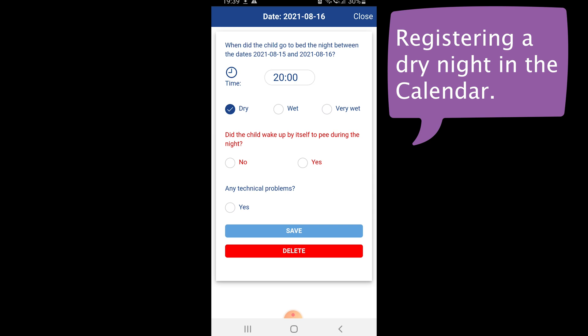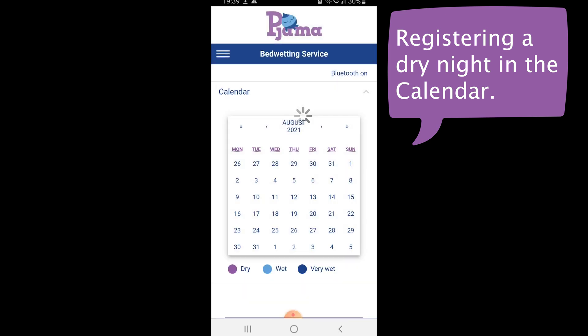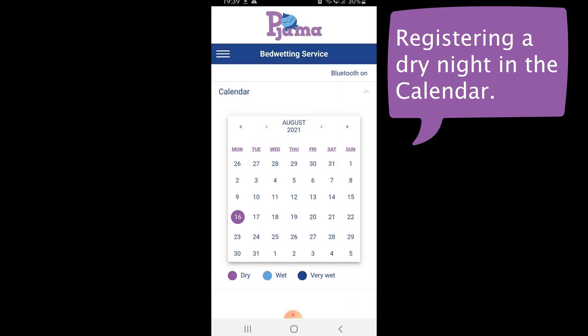The question of whether the child woke up by itself to pee during the night is answered as well. Next, select save to complete the calendar entry. This procedure is all you have to do when the child has had a dry night.